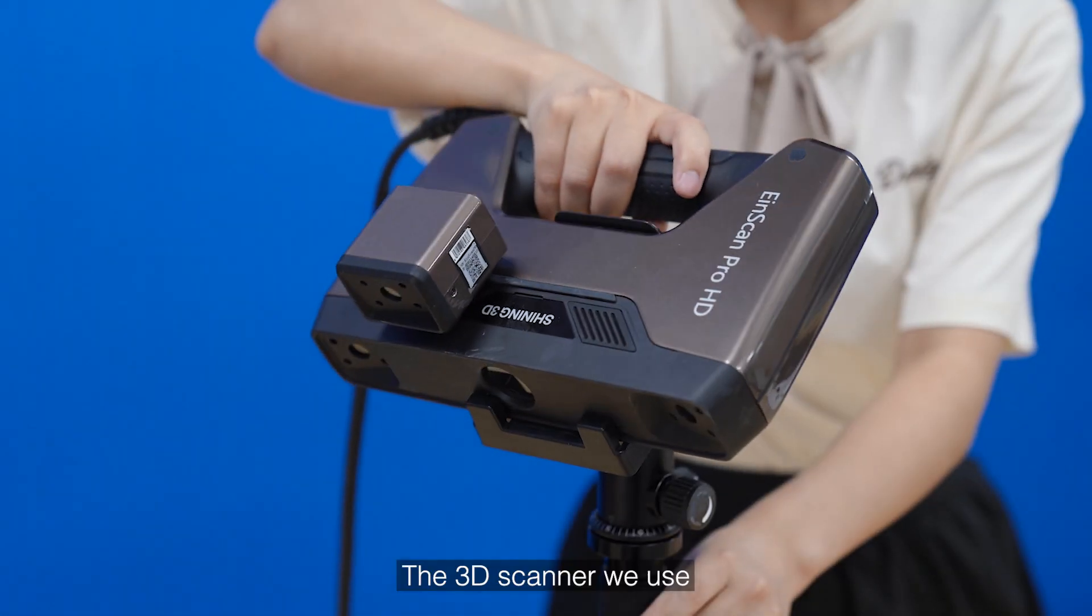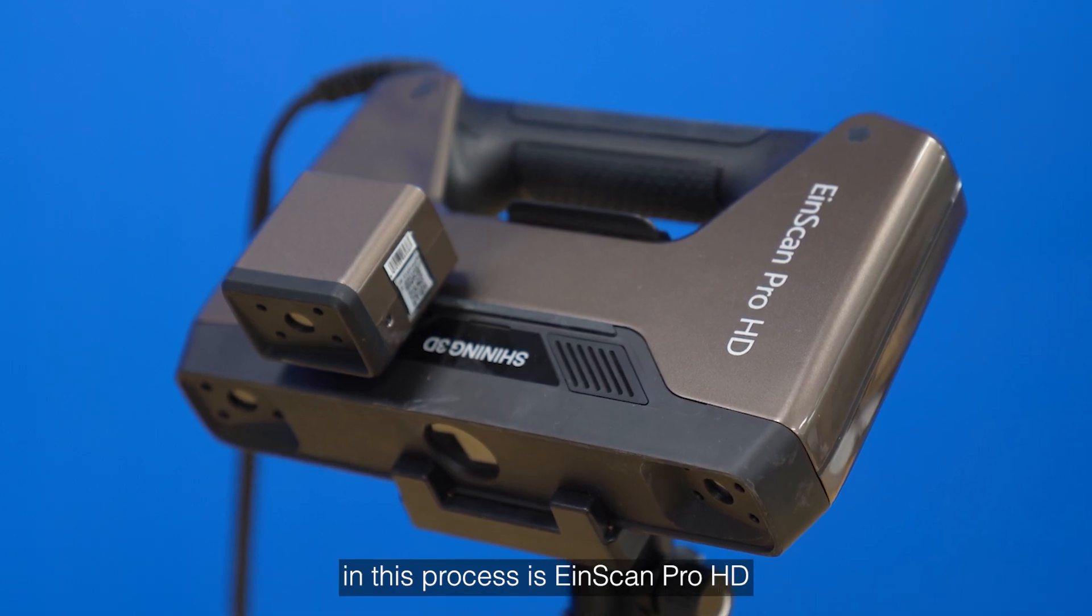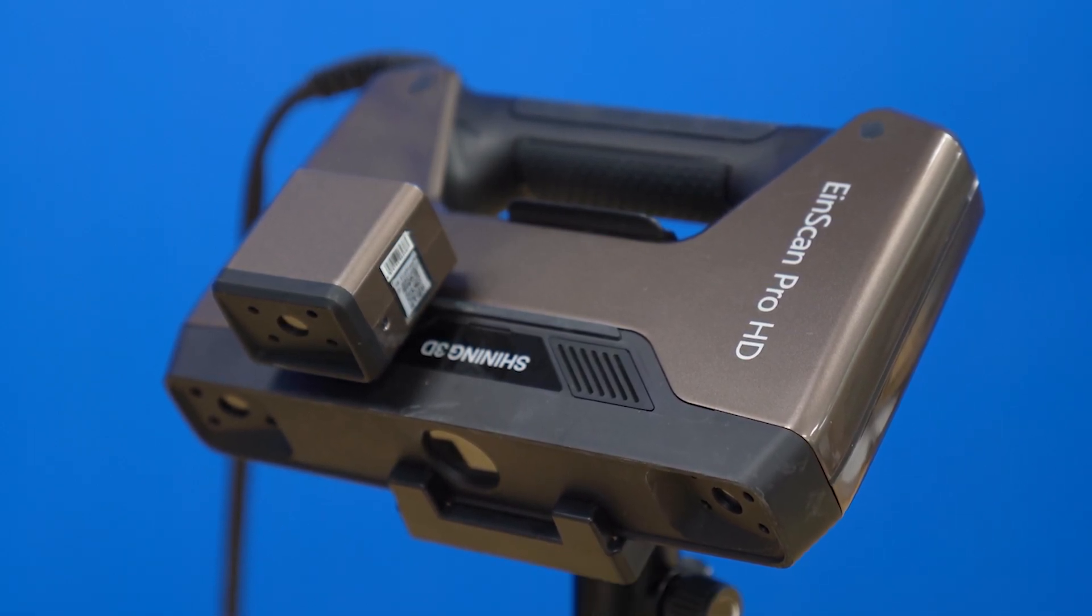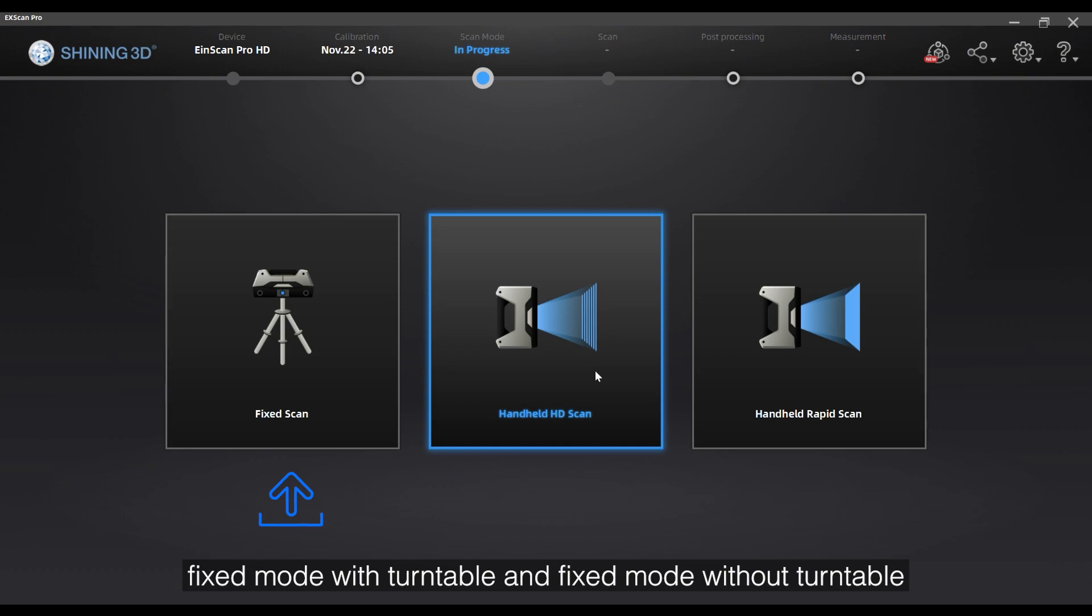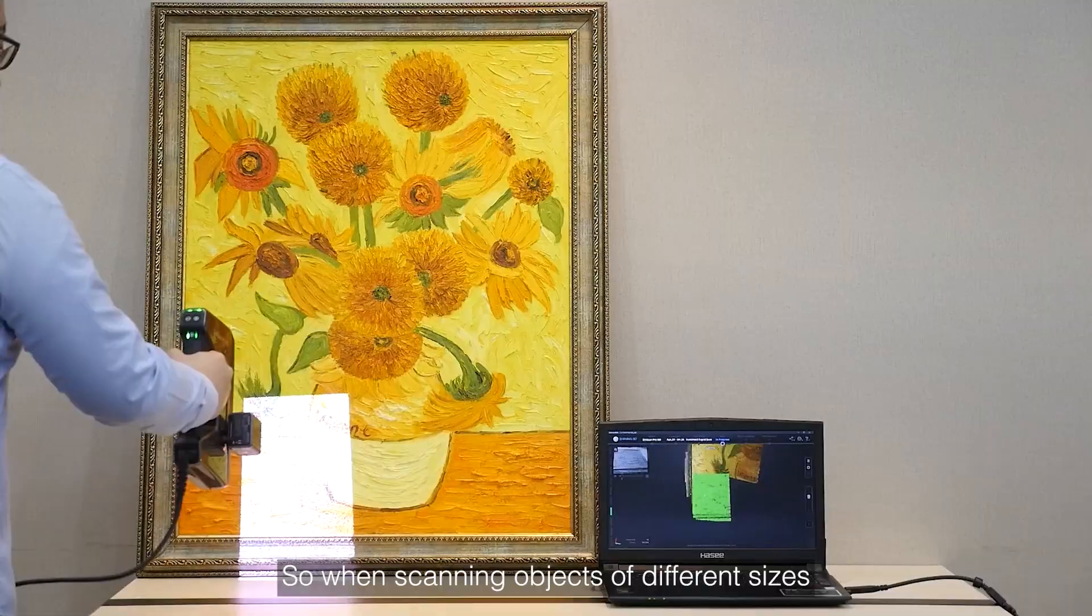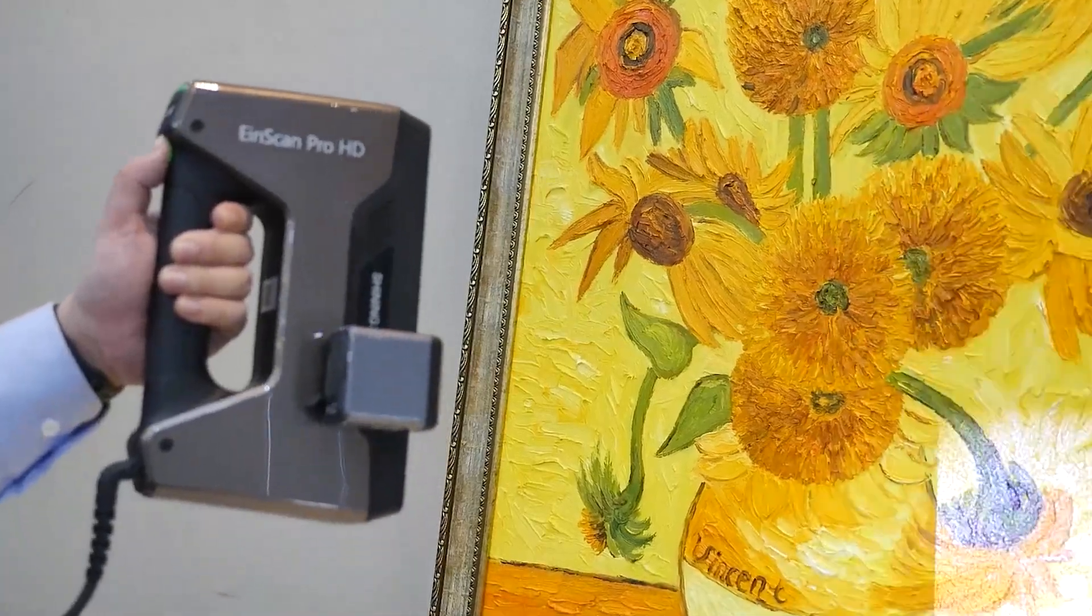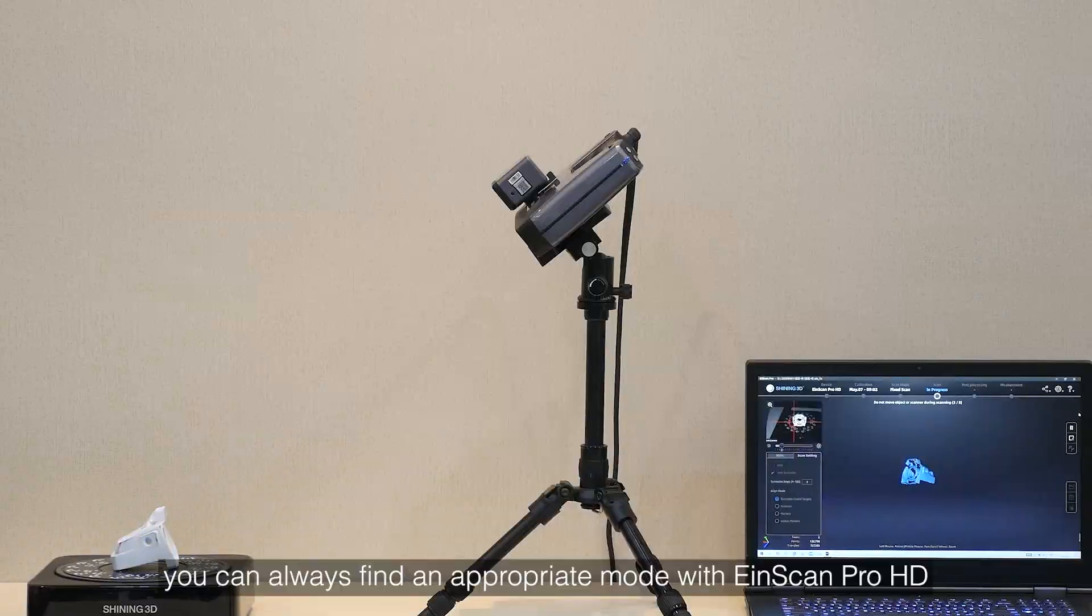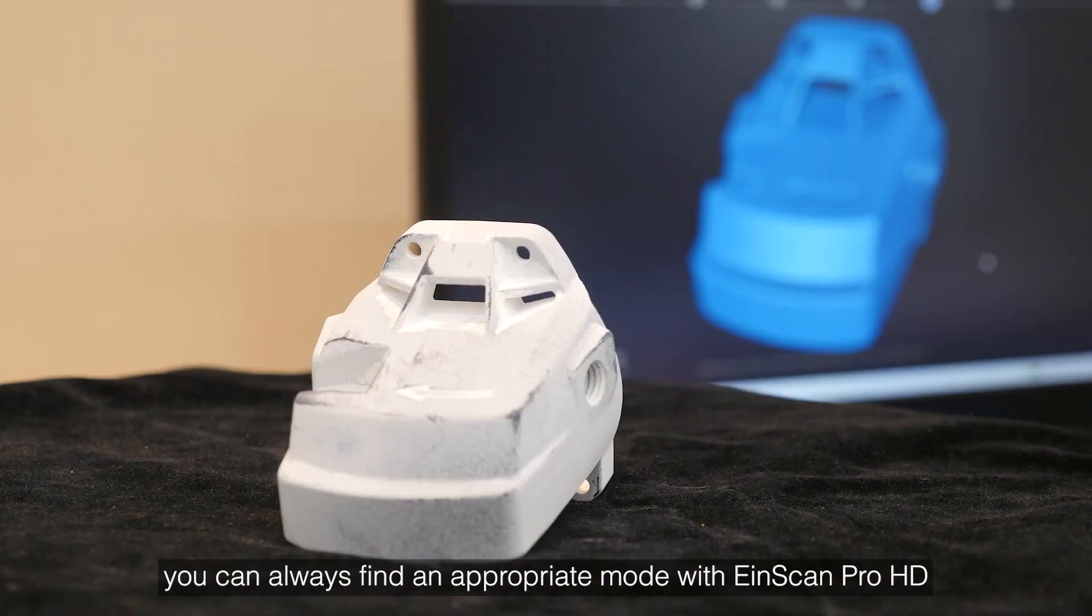The 3D scanner we use in this process is EinScan Pro HD, which is available in handheld rapid mode, handheld HD mode, fixed mode with turntable, and fixed mode without turntable. So when scanning objects of different sizes, you can always find an appropriate mode with EinScan Pro HD.